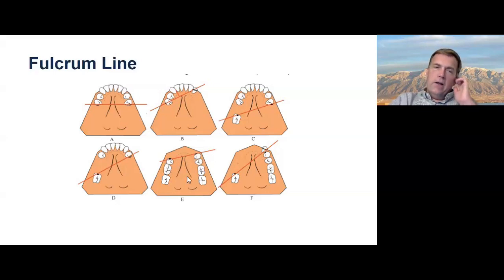the red line. So what we can do is put some clasping, like maybe put a double clasp on both sets of molars, and then maybe an indirect retainer on the premolars there. That way we have really good retention, and we're also resisting that torquing force as much as possible.